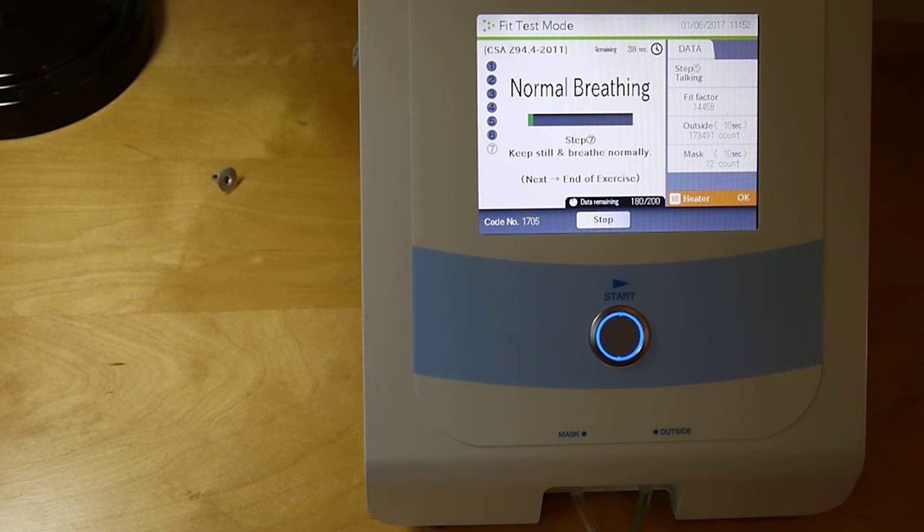Back to normal breathing. At any time, if the mask is leaking too much, the unit will show that in the step result and will not give an overall pass. Everything looks good here, so we have a good test.